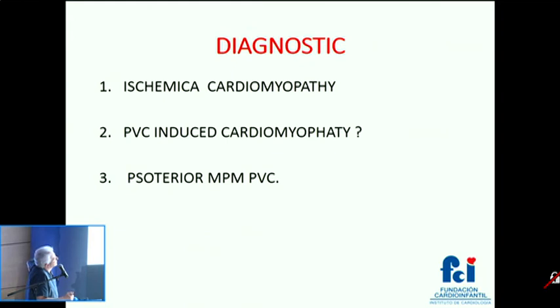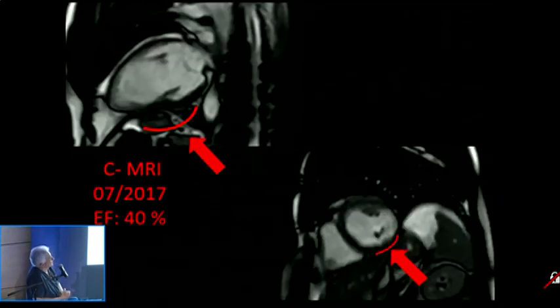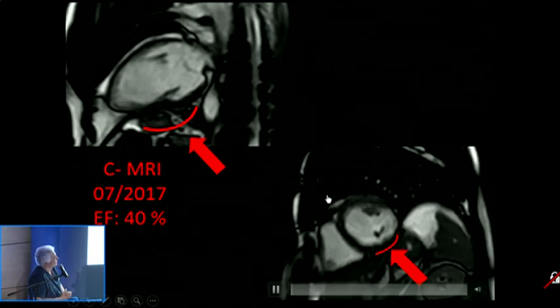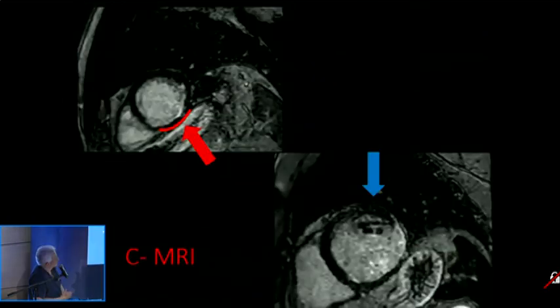These are the diagnoses: ischemic cardiomyopathy, PVC-induced cardiomyopathy, or posterior papillary muscle. I don't see the papillary here. No, I'm sorry. Luis, the papillary is very small as compared to the anterior.